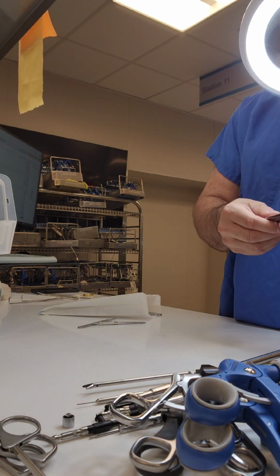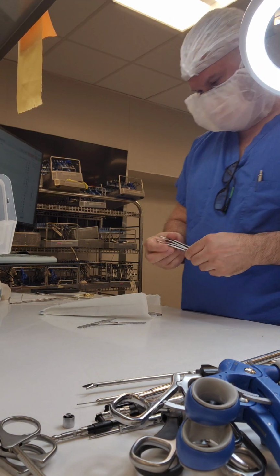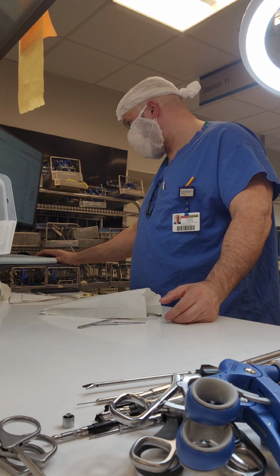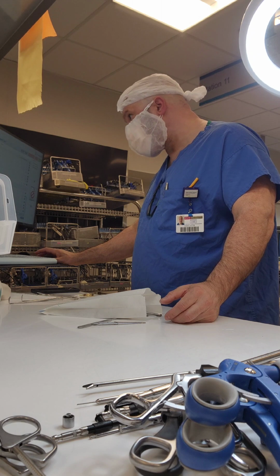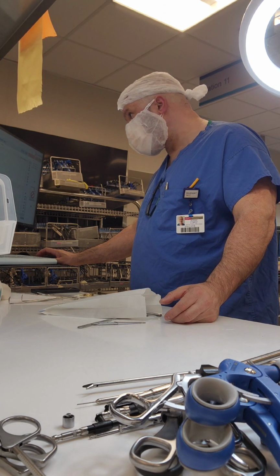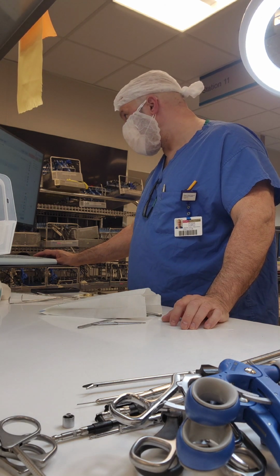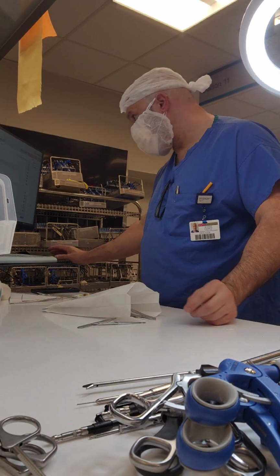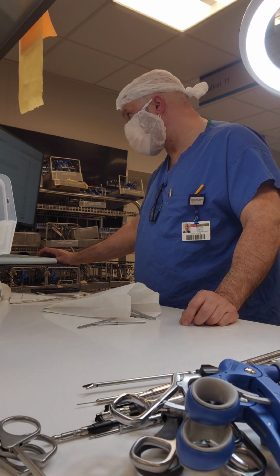Always checking that the tips meet and that they close properly, especially with toothed instruments. Those instruments, the tooth can actually wear down, or kind of be like snaggle tooth, I say, where it can be off to the side. You want to make sure that it closes correctly.